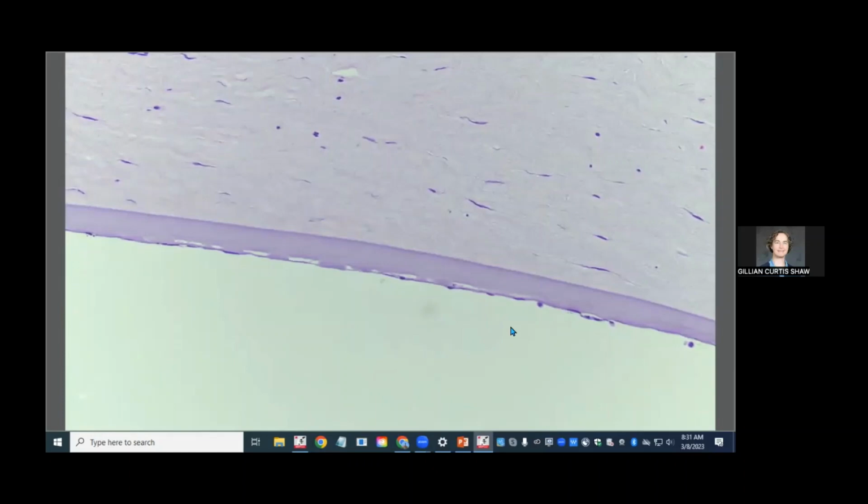What are these things made out of? Gutata? I think they're just Descemet's membrane, right? Can someone tell me? Yeah, it's a poorly formed basement membrane, in this case, Descemet's membrane material produced by the dystrophic or abnormal endothelial cells.